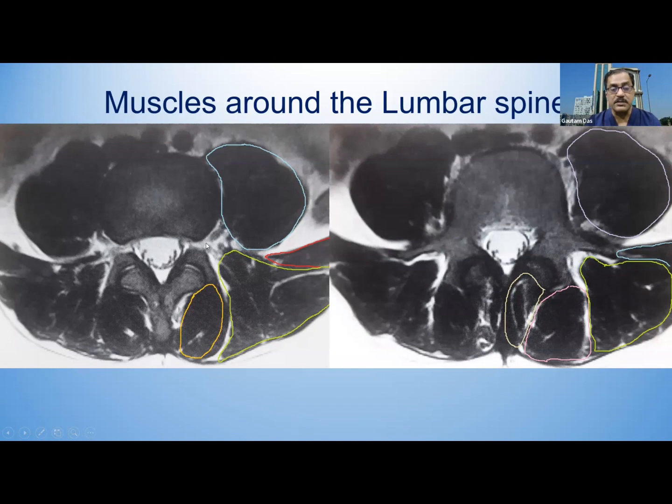So these are the three erector spinae group of muscles, and this is your transverse process in this view. Just in front of that, if you are giving an injection, that is your erector spinae block. The erector spinae block can be done in the thoracic area as well as in the lumbar area. And here, at the tip of the transverse process, the quadratus lumborum muscle starts. The quadratus lumborum muscle starts from the tip of the transverse process, and it runs between the two fascial planes. So anterior to the quadratus is the thoracolumbar fascia.